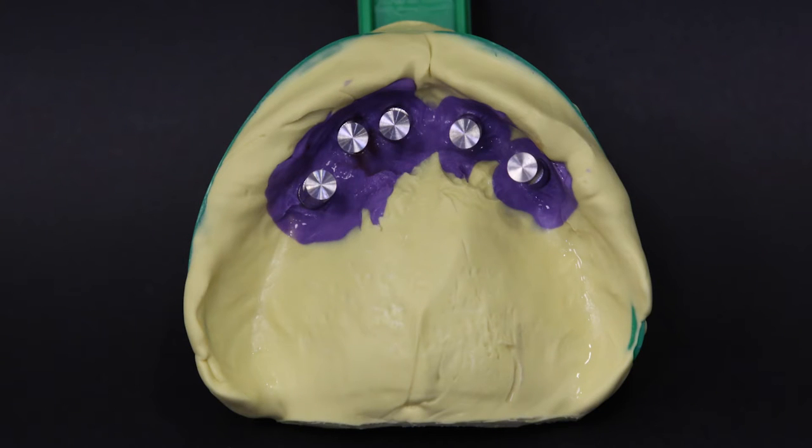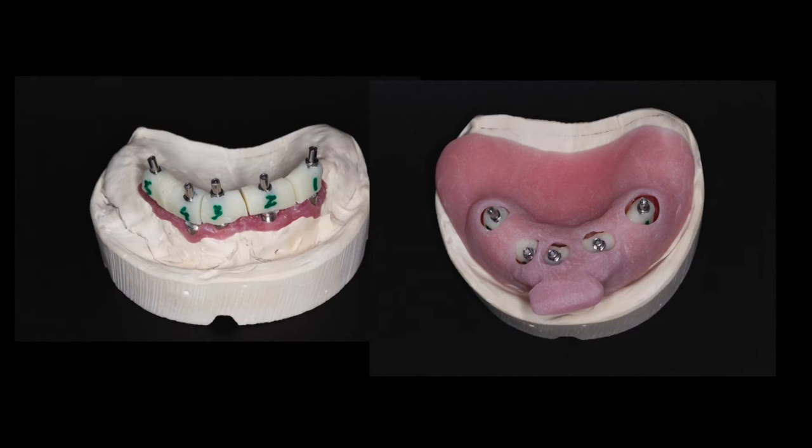The reason why I like to take a preliminary impression and send it to the lab to have jigs back is really two-fold. First, I like to receive jigs that I can connect in the mouth to verify the inter-implant position. Second, I like to receive a custom tray from the laboratory. With a custom tray, I can do my border molding and push the impression material to the areas I need to extend to in order to capture a very accurate impression.